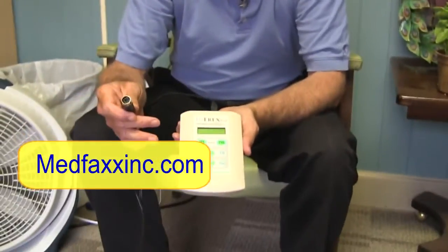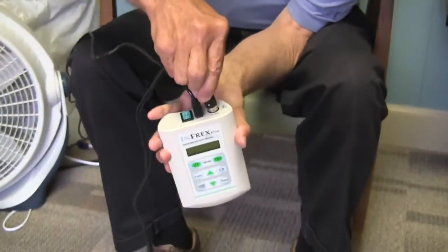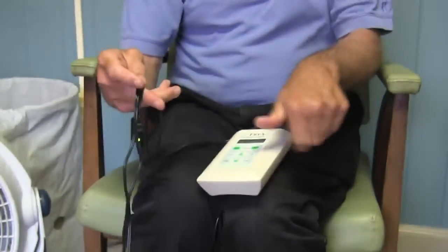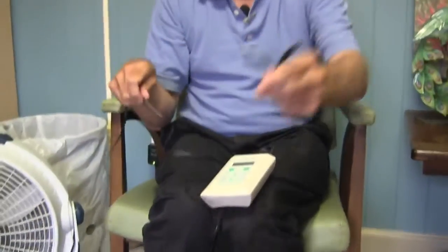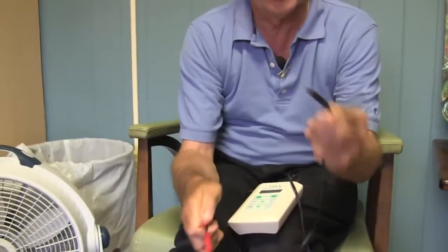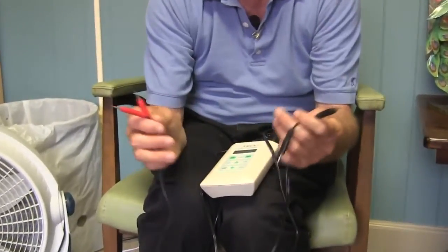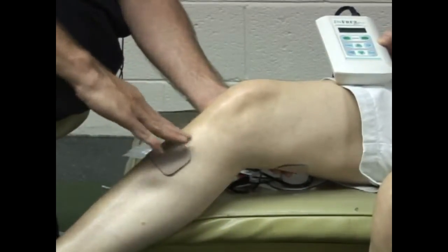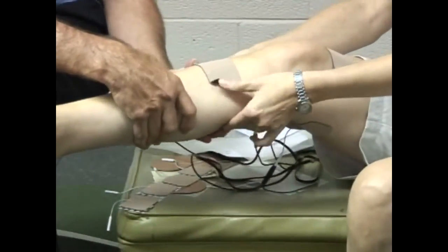Once you've taken the unit out of the box or out of the carrying case, you take your cable and you put it right in the top — just drop it in. Your cable goes in and you have two blacks, two reds: channel one and channel two. It does not matter what we call poles. This is where you attach your electrodes. The basic rule with electrodes is to put them so that the area of pain is in between them. We'll be glad to walk you through that if you want to call us.